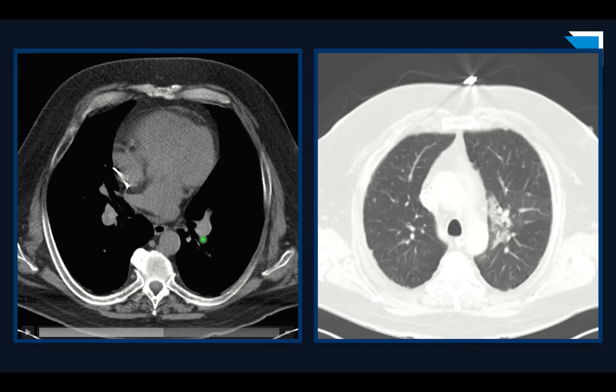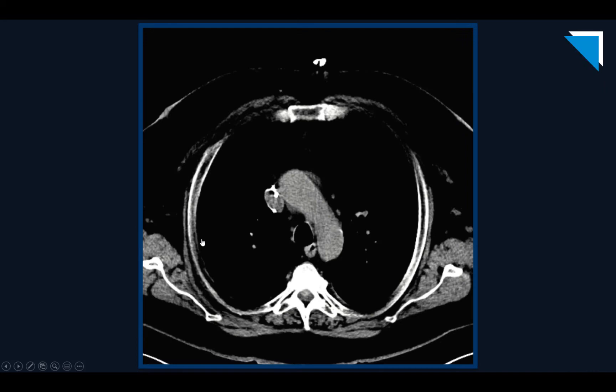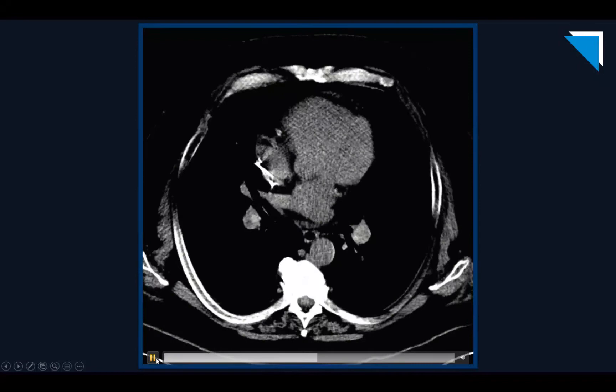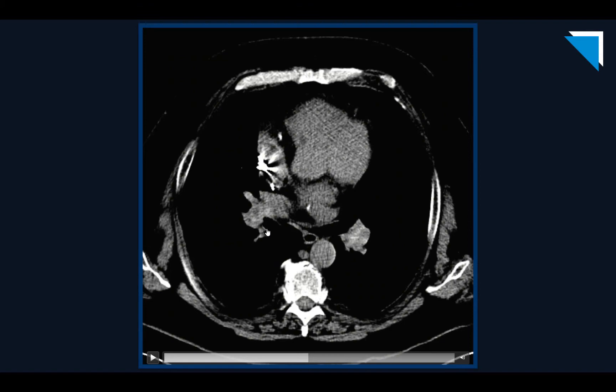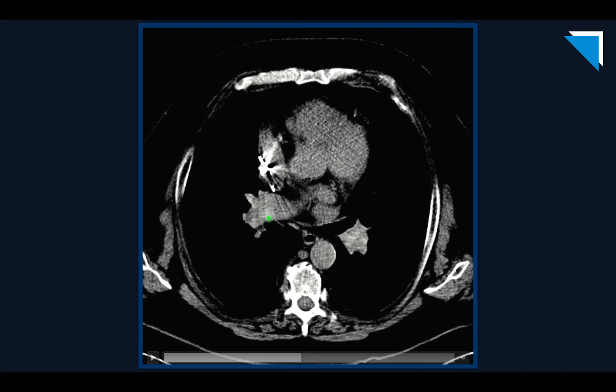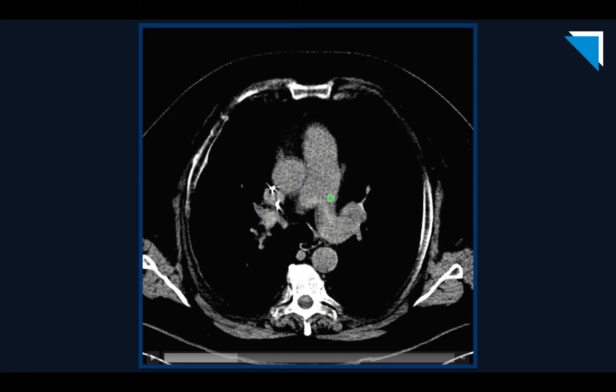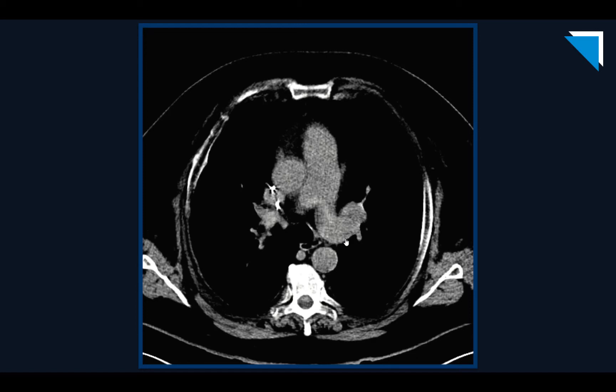Let's put it in liver windows to see if that accentuates the finding — it's a little better. There we go — this linear material here. Dr. Lee put it all together and said this patient has a very large amount of acute pulmonary arterial embolism, and that the ground glass and consolidative opacity in the left upper lobe was a pulmonary infarction.